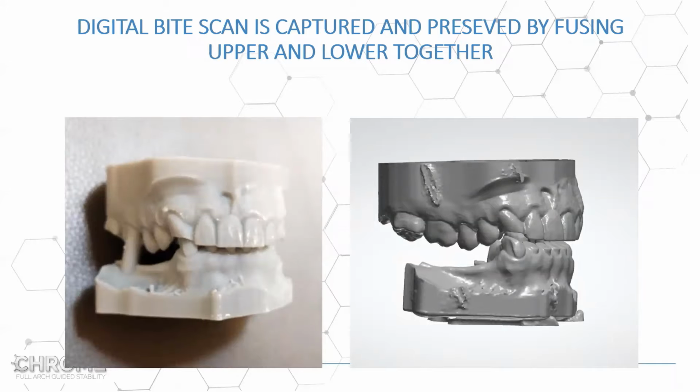So now I'll show you some of the things that we receive here that we question, that sometimes we can't develop good planes of occlusion or good aesthetics, or have enough bone for implants, or have enough restorative space because of the bites that we receive.